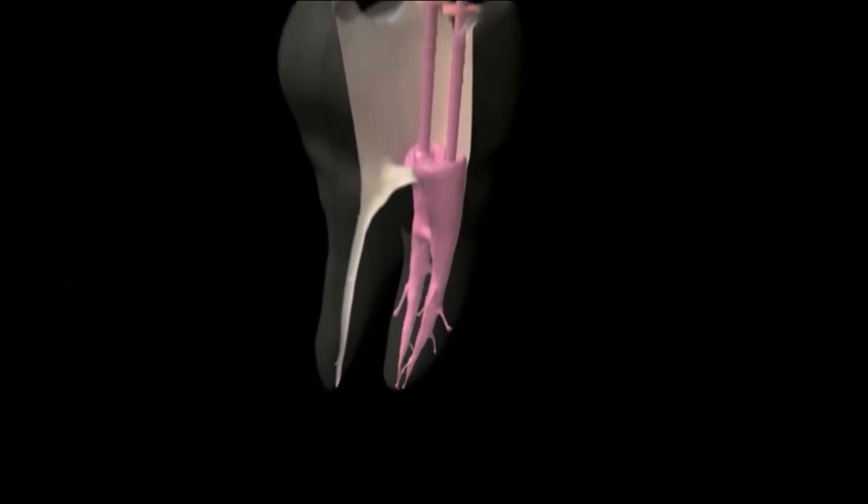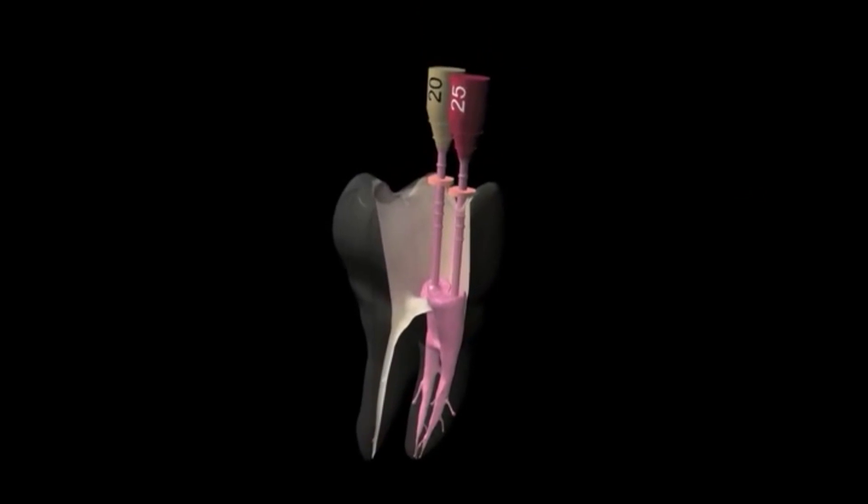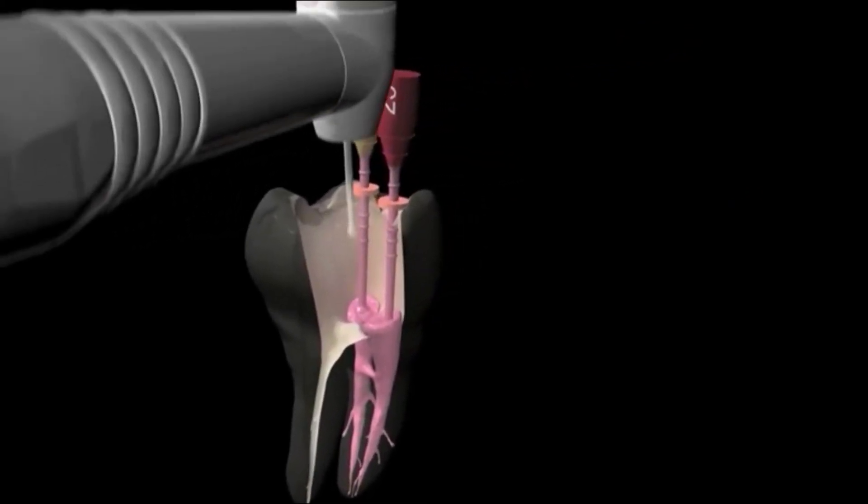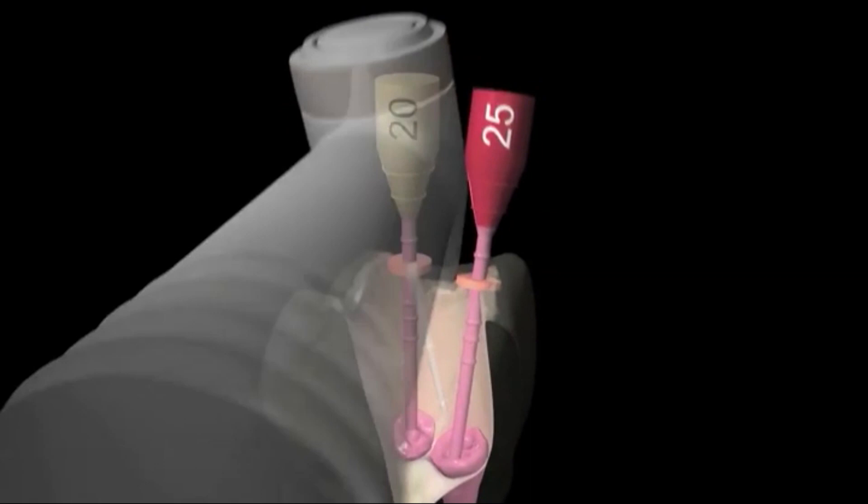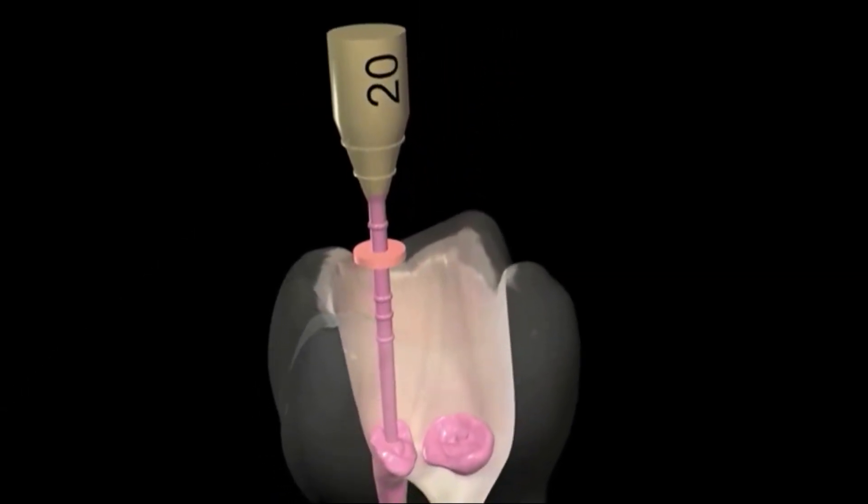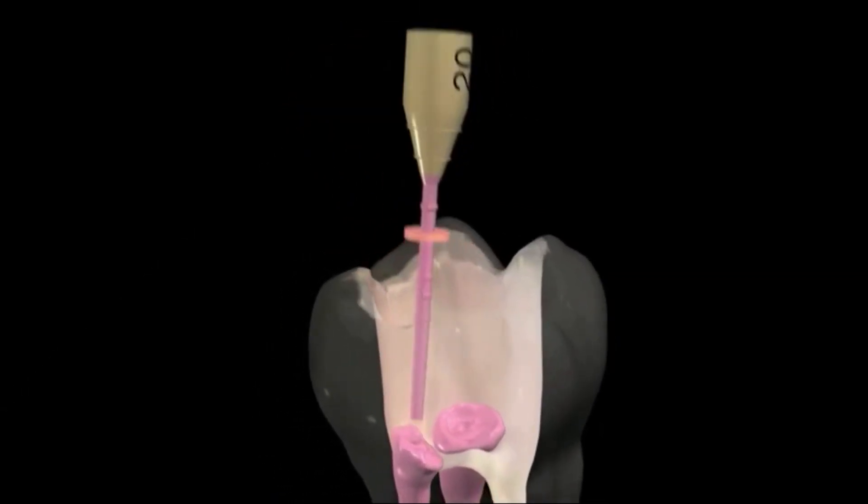When GuttaCore reaches its working length, use a round burr to sever the obturator at the canal orifice. You can also remove it by bending from side to side without impacting the seal.